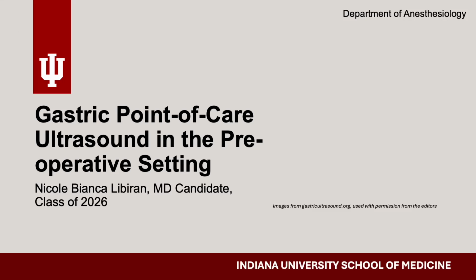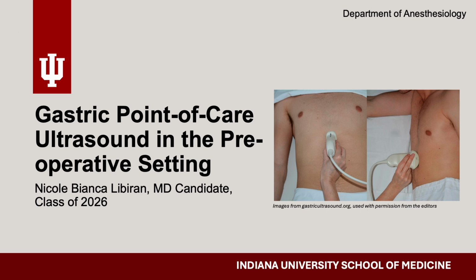Hello, my name is Nicole Bianca Libiran, IU School of Medicine MD candidate class of 2026, discussing preoperative gastric ultrasound.